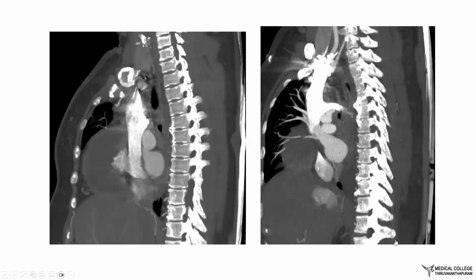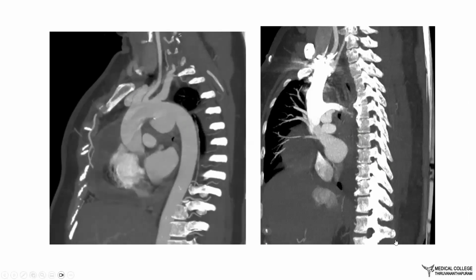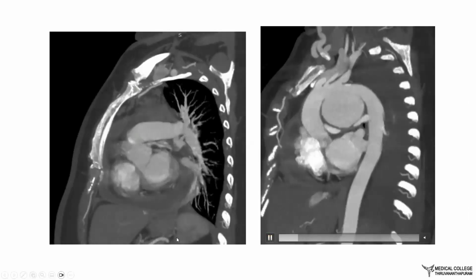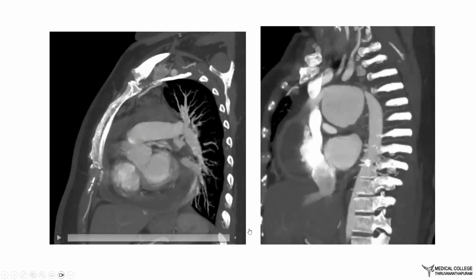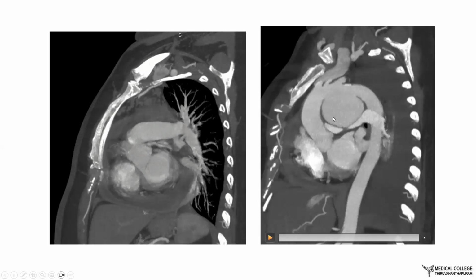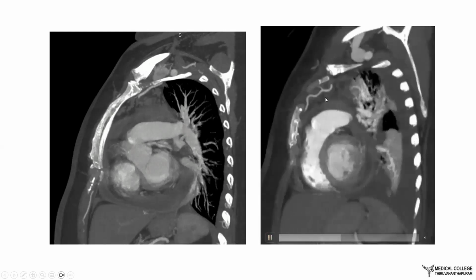The patient had told us that before surgery, she wanted to go home and then come back. So we thought we'd just take a CT before the patient is let off, and then we'll plan the endovascular procedure accordingly by the time the patient comes back. And to our shock, we found out that the aneurysm had almost doubled in size in the 3 weeks that the patient was on antibiotics.